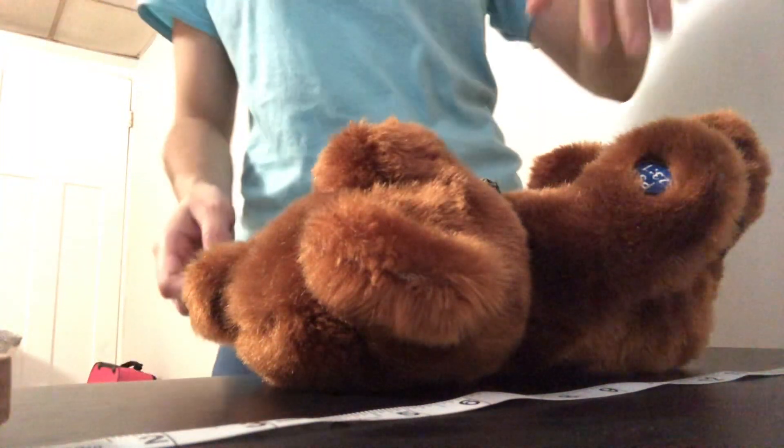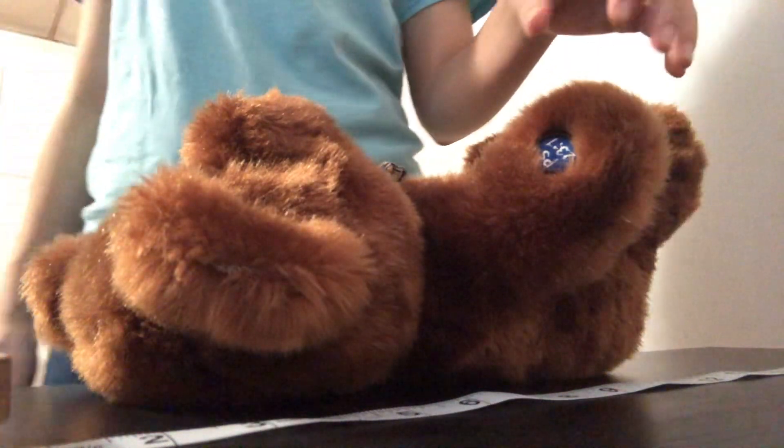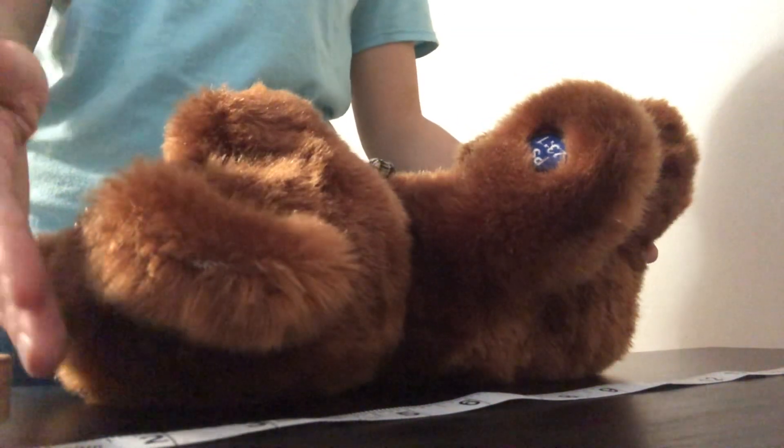I'm then going to place the baby at the back of the table. Now if there's a headboard, I will be telling the parent to hold the baby's head at the headboard zero mark.